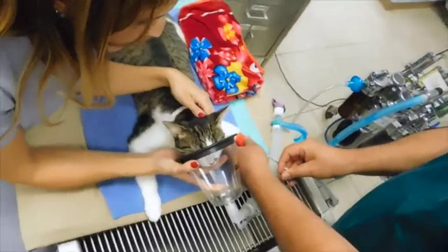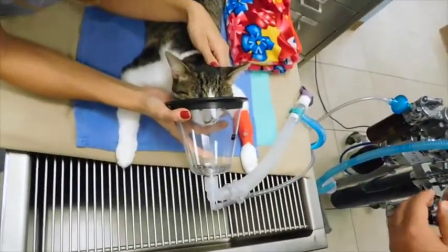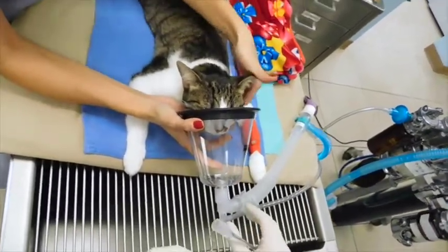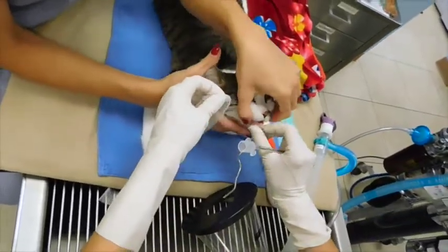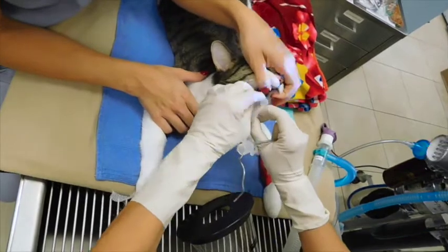We are intubating Nurse Barbos, who, before the dental procedure, was pre-medicated with hydromorphone, midazolam, and alfaxalone.